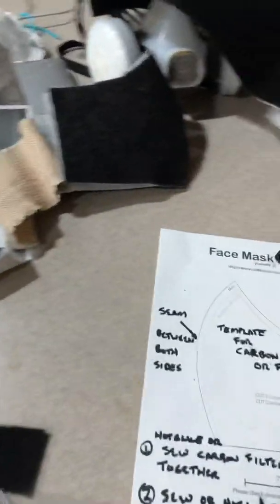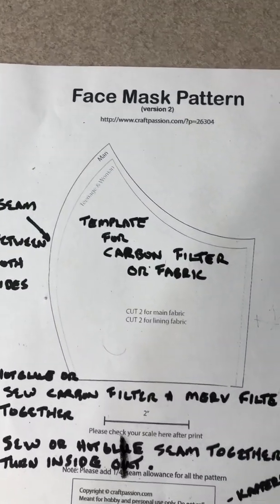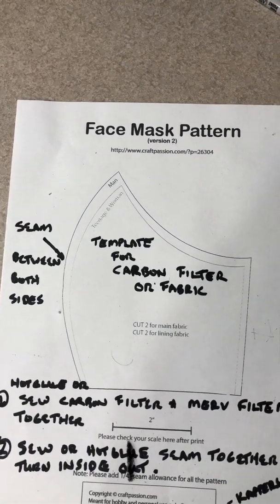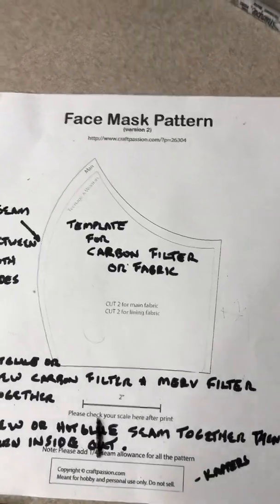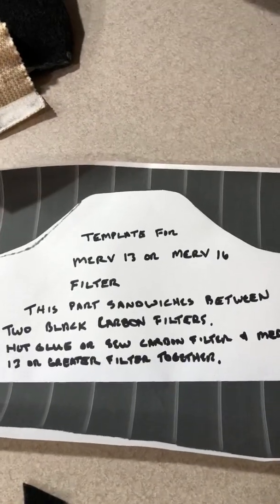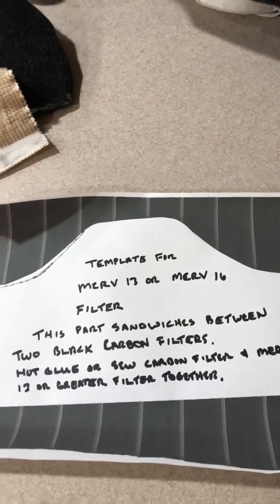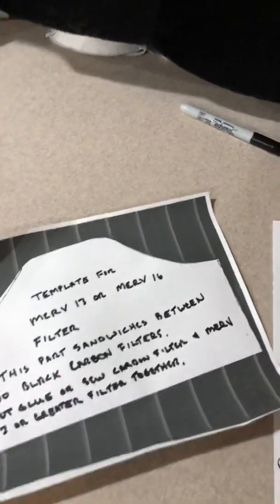Let's run through the process of making some of these N95 masks. We start with a mold, and basically here's a template for it, and we'll walk you through that. You can either sew it or hot glue it together. That's the template for the mask, and this is the template for the eight-and-a-half by eleven — the template for the MERV 13 or MERV 16 filter that is a good enough filter to filter out any of the COVID-19 virus.